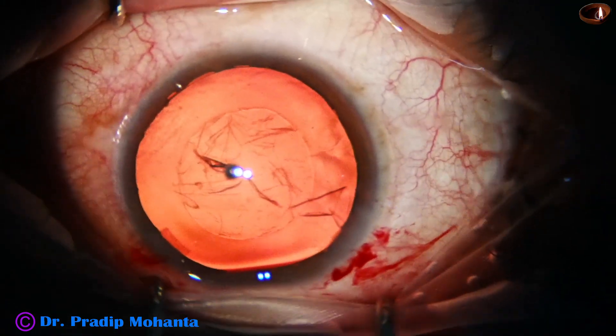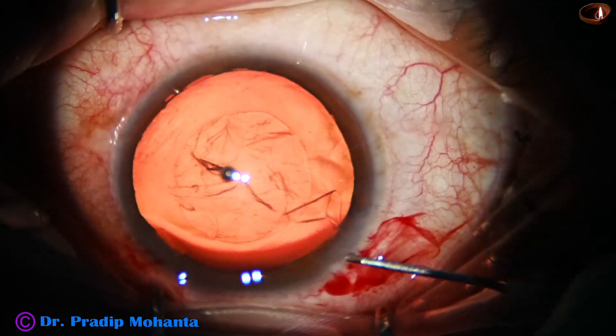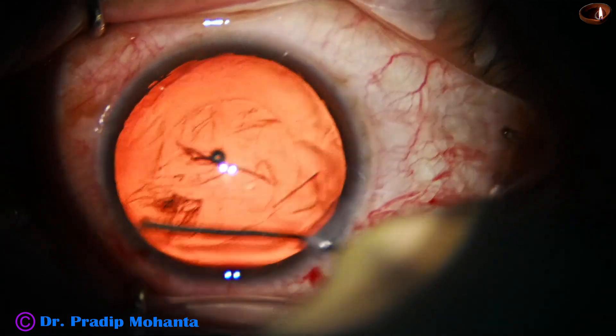The power of the intraocular lens in this case is 7 diopters. The patient is a 45-year-old lady.